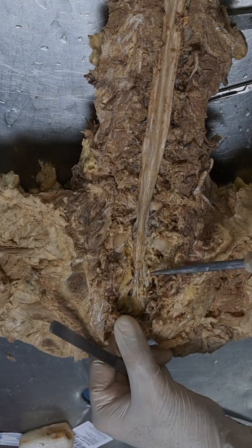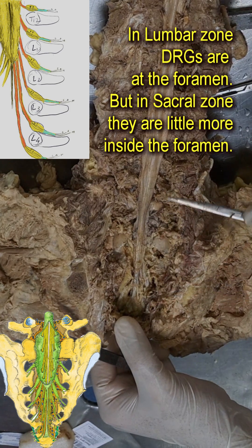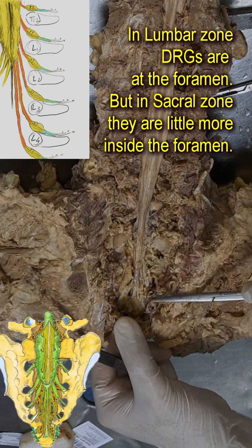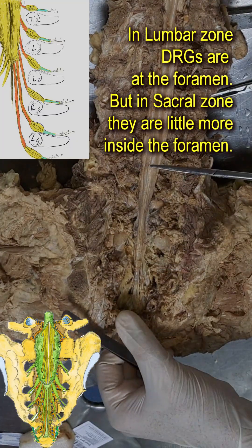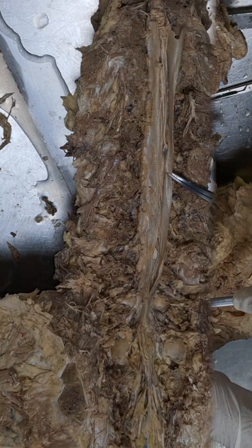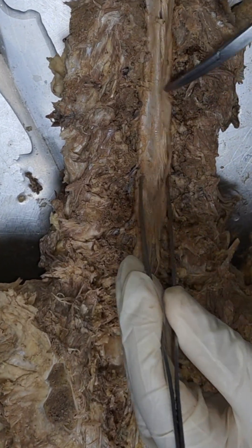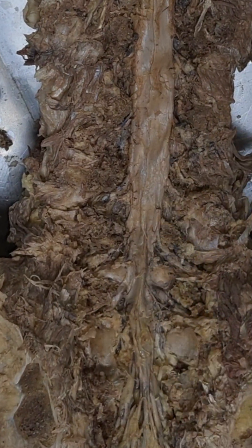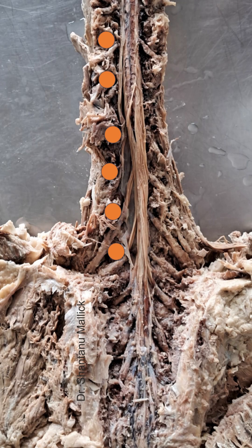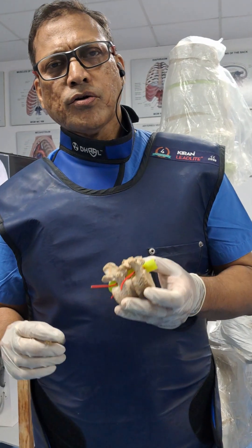Dorsal ganglia at the sacral level are quite far inside the foramen — they are not at the outer foramen. The sacral level dorsal ganglia are deep inside the foramen because of the pull of the spinal cord during aging from childhood to adulthood. This covers the concept of dorsal ganglion RF and the position of the dorsal ganglion.